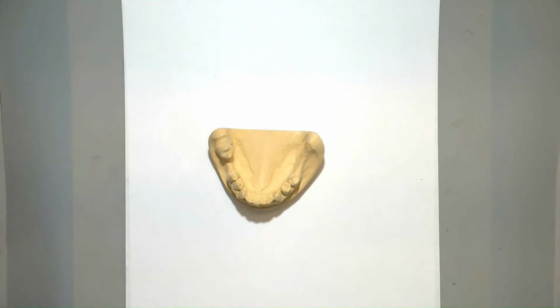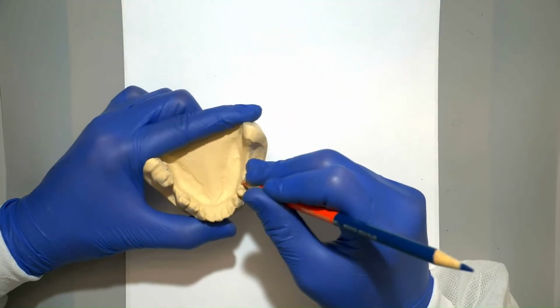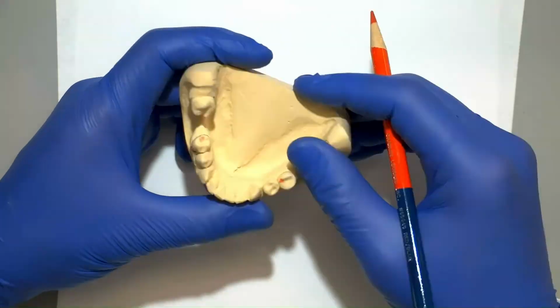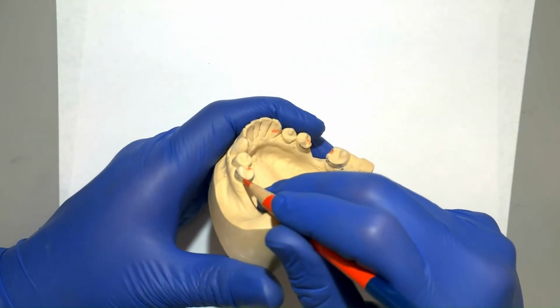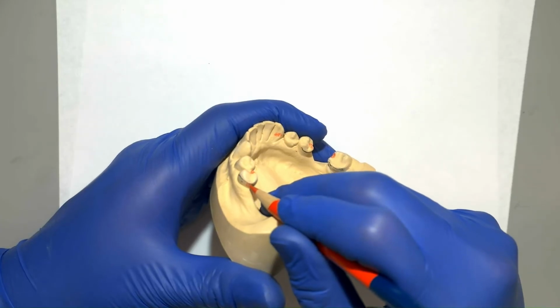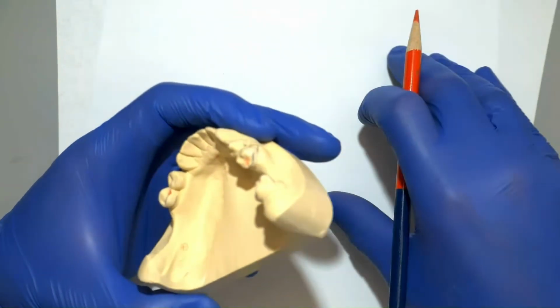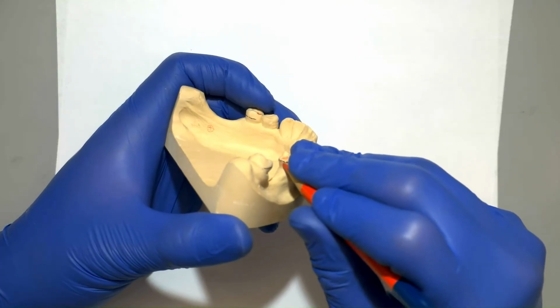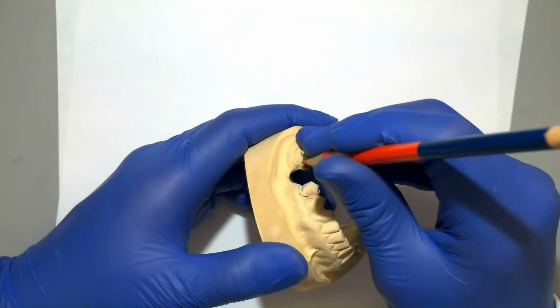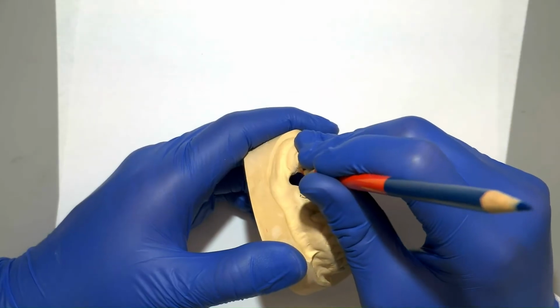With that, we can now transition to drawing the same design, but on the cast. We will start by drawing our rest seats in red. The next thing to do is to draw the areas of the guide planes. Red denotes areas included in the mouth preparation. That includes areas like guide planes and undercuts that are going to be added or adjusted on the patient's mouth.